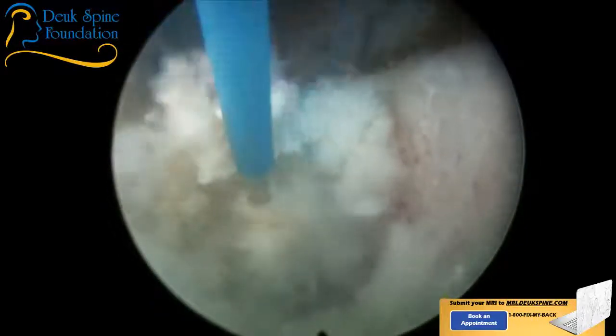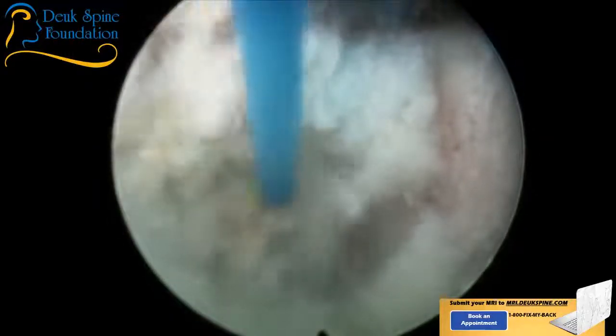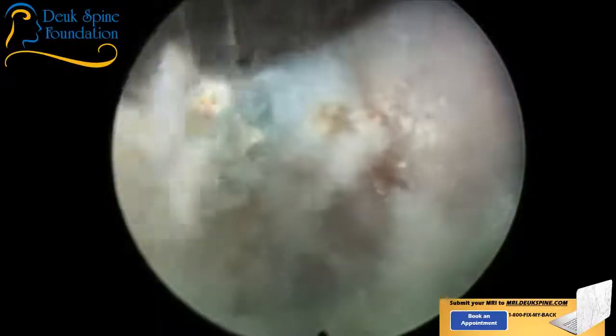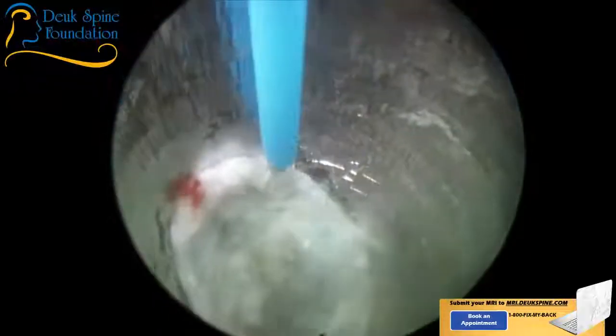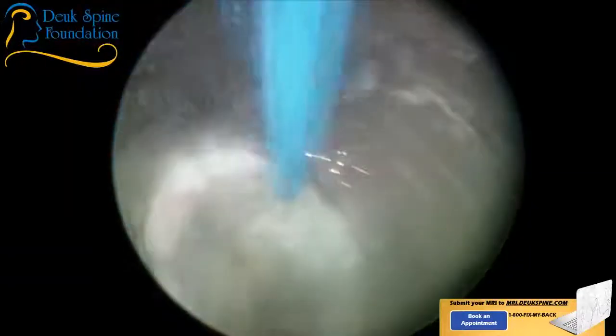And finally, the therapy is very important. Unfortunately, some of my patients don't get the message. I tell them to do the therapy. By the way, that's the end plate over there to the right. So we're really just right on the end plate. We're not going to mess with the bone at all. The end plate is the bone.